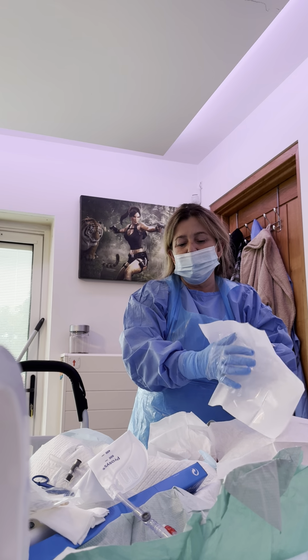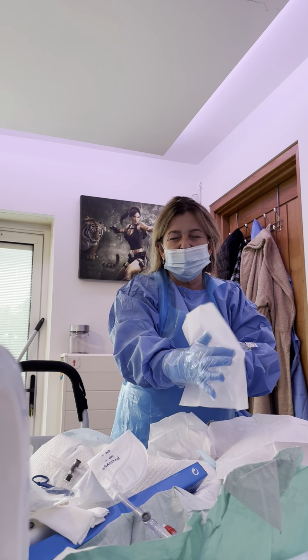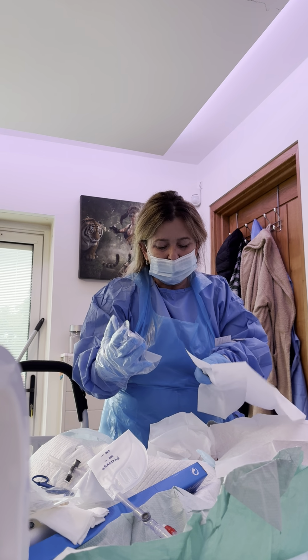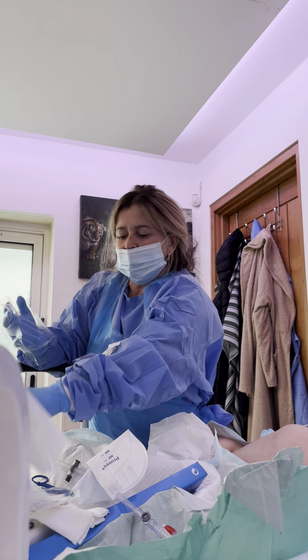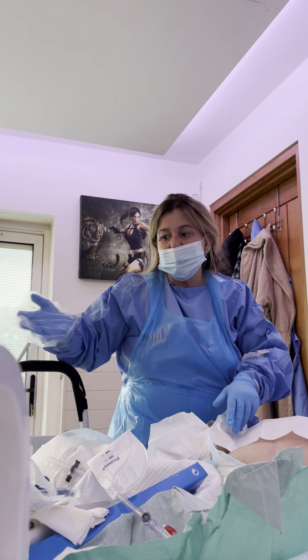And rather than put 10 mils in, I'll put 10 mils in and then put an extra mil in, and that will just keep it in. So again, get rid of that one there. I have to put everything to the dirty sterile pack, which is still clean, but it's dirty. And I can use this hand as my dirty hand. So this hand out and lift. So you're lifting the belly up. You're bringing over the sterile pack here, which is right in front of me.